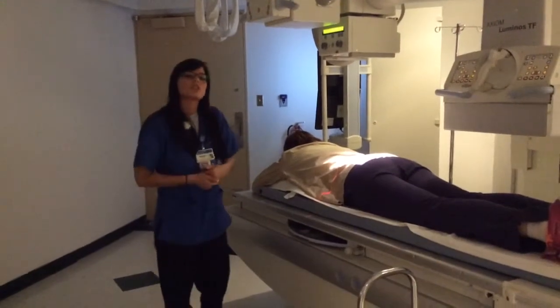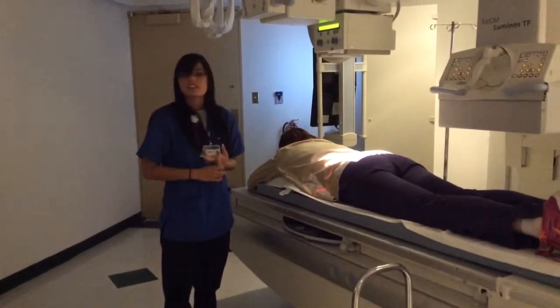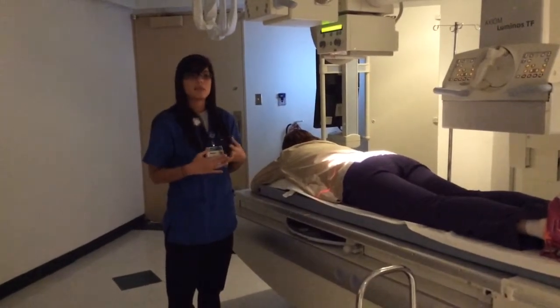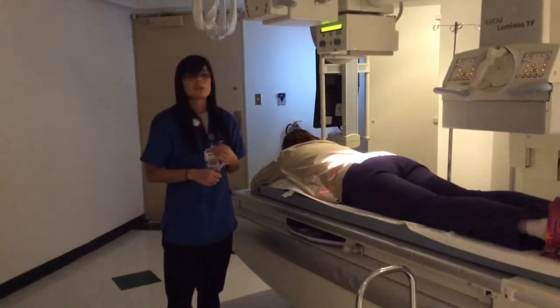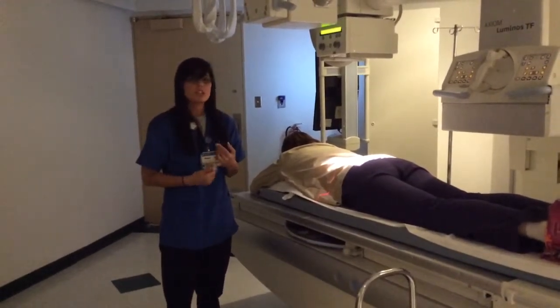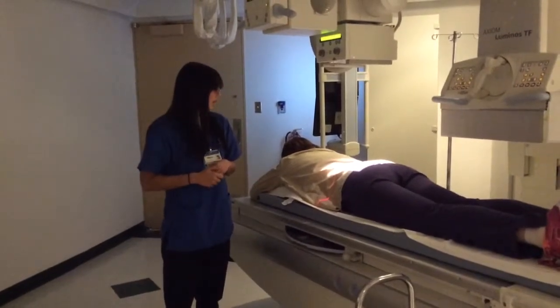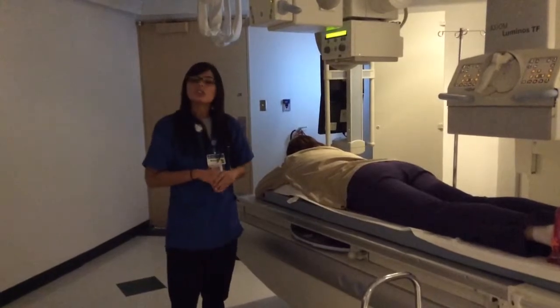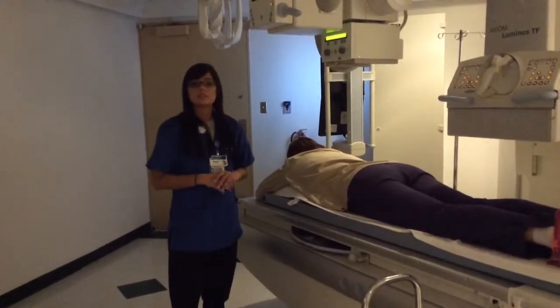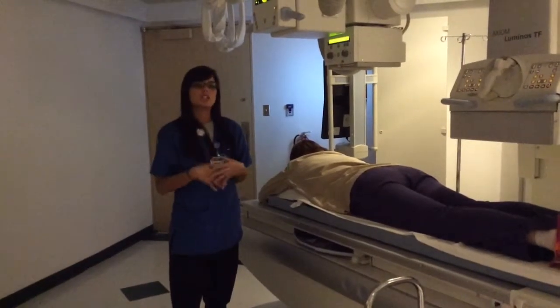When the patient enters the room, I would introduce myself and verify their date of birth, last name, and any allergies. And because this is a contrast exam, I would also ask about any previous surgeries to the abdomen, any known bowel obstructions. After that, I would give the patient 2 cups of thin barium to drink. Let them sit for about 15 minutes while the barium works its way to the small bowel.